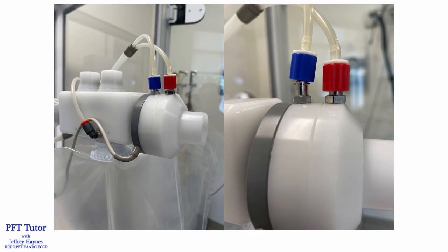Obviously, one of the most important things for us to verify is the accuracy of our flow measuring device. In this case, we were using a pressure differential pneumotachometer that measures the pressure across a metal screen. So if the distal pressure port, colored in blue, is not seated properly, the pressure differential across the screen may be higher, leading to inaccurately higher values.